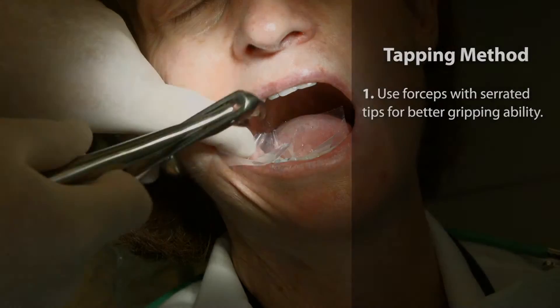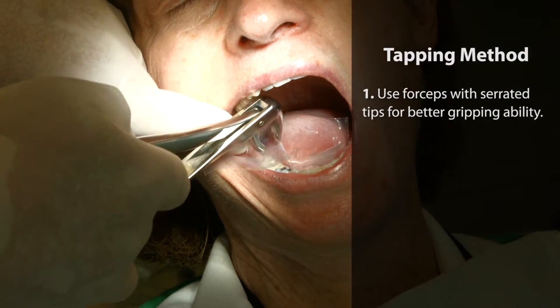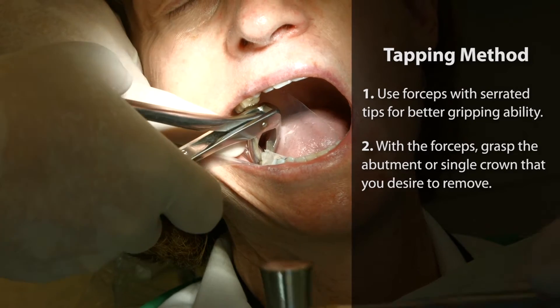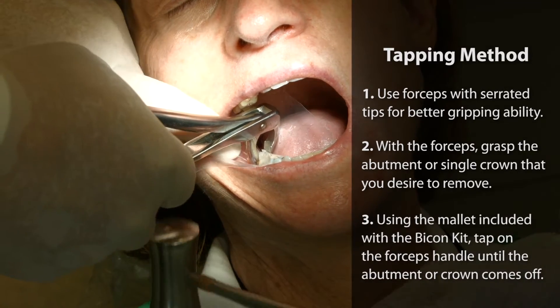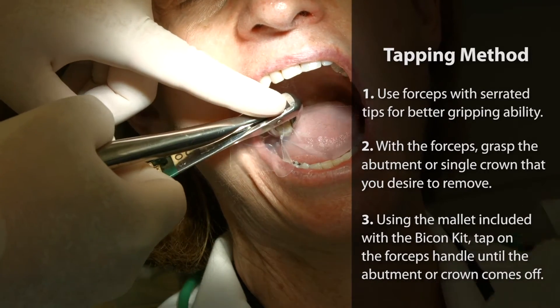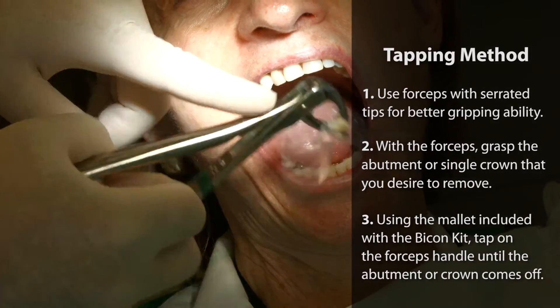We have basically two different techniques: the tapping method and the twisting pulley motion — both are simple and straightforward to perform. First, we use an extraction forceps. Once you grasp the crown or the abutment that you desire to remove, you use a mallet that comes with a Bicon kit and tap on the handle of the forceps until the crown or the abutment is out.